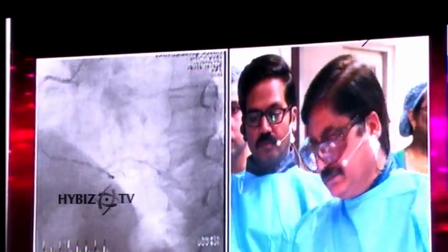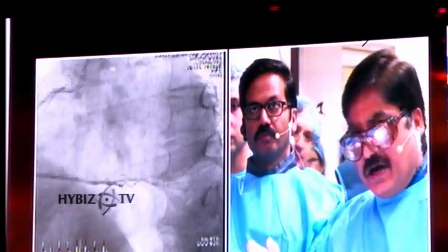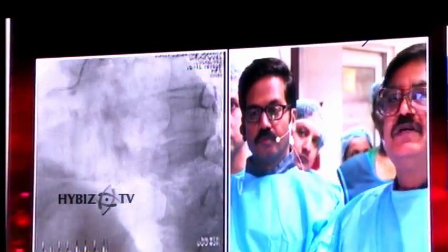Yeah, correct. So, correct. So this is a pretty standard left main case, I would think.